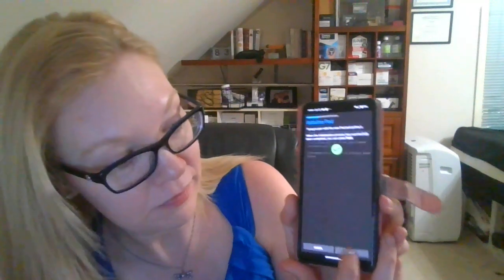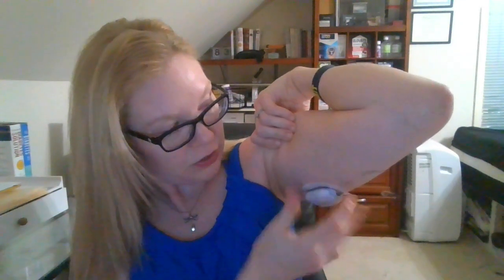And I'm going to be placing this pod on my other arm. I usually just switch arms back and forth and try to find a spot I didn't use previously. So I'm clicking Next. Now it's telling me to attach the pod. I'm going to pull off this little blue plastic piece, then pull off the adhesive paper, and place it on a spot on my arm. I'm going around just laying the paper flat, and then I'm going to click Next.